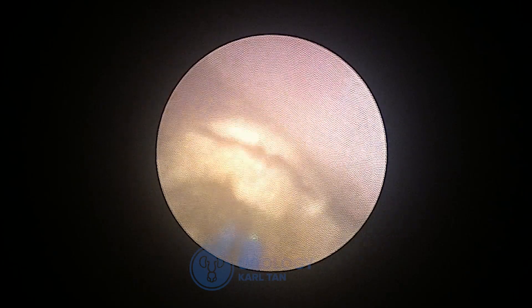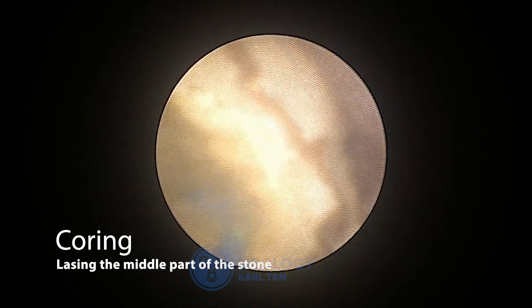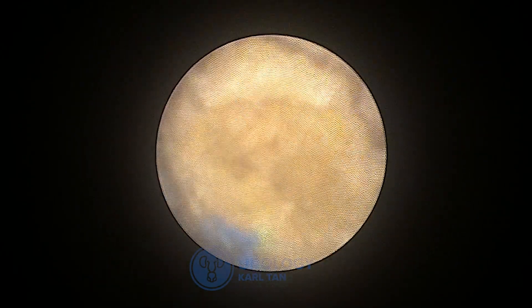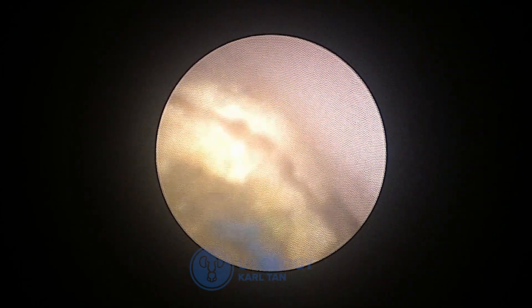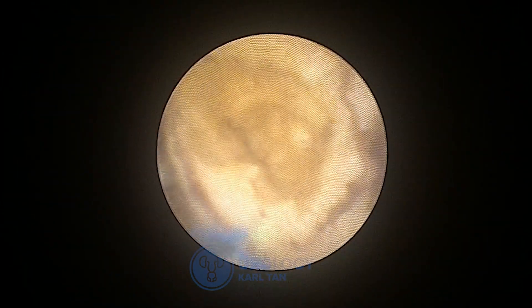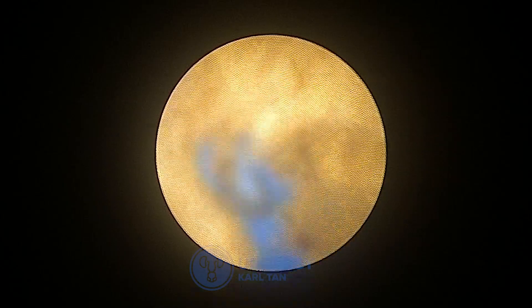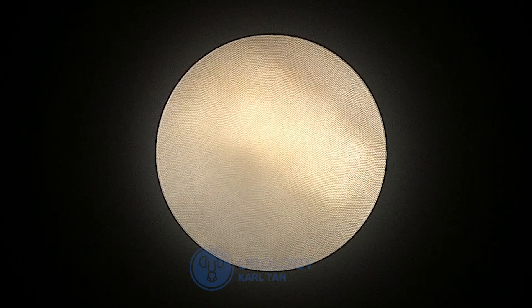The method I'm showing right now is called coring — we try to laser the core of the stone so we can clear out the middle part later. We then try to collapse the stone so we can easily dust it and avoid injuries. You can see the fine dust coming out once the Thulium Fiber Laser touches the ureter and stone.